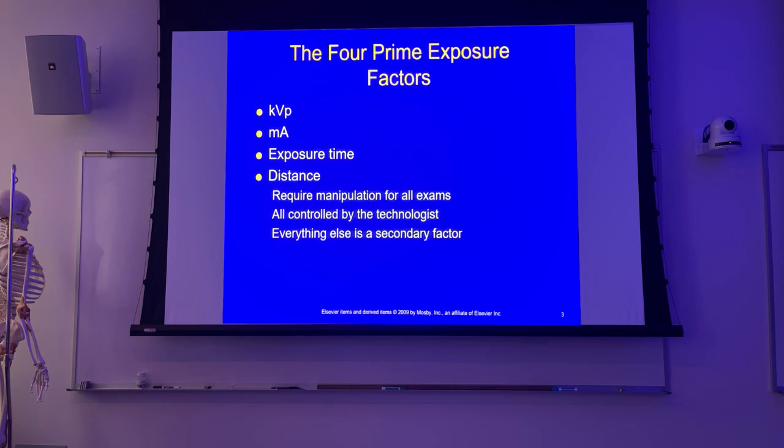The perception here is that we have a tendency to think that as we change from single phase to three phase to high frequency, we're increasing the energy, which we are, right? We're increasing the energy and we're increasing the intensity. So you may look at voltage ripple and say, well, single phase is going to give us a lower amount, and single phase to three phase is going to give us an increase. But if you look at that, it might confuse you a little bit, because it says voltage ripple decreases.